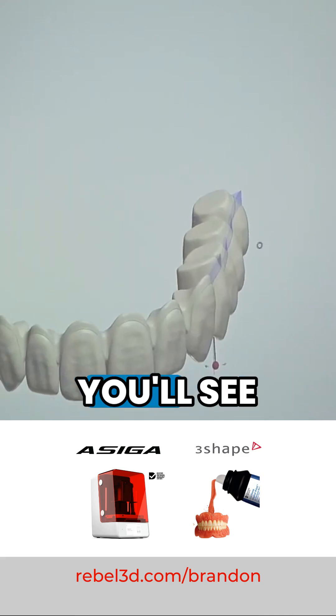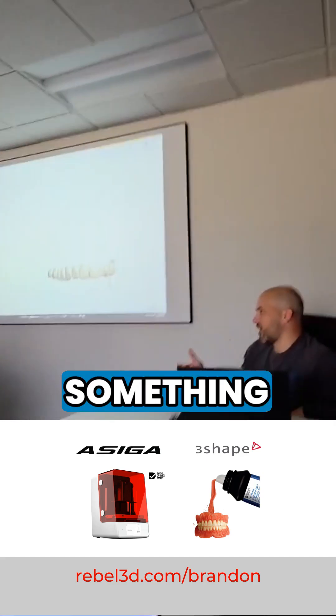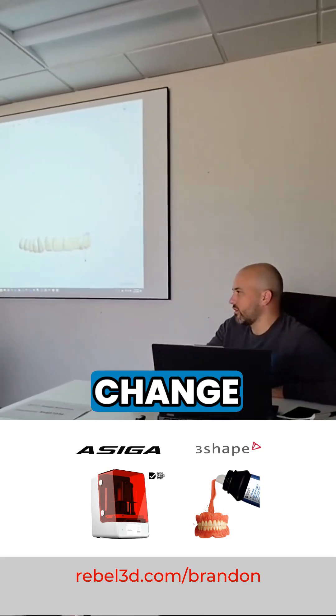When I hit preview here, you'll see how it changes this last one. It does it automatically. Now, every once in a while you'll get an error saying that you need to adjust something — that's when I'll make a change. But I usually go by the default. If it comes up fine, I don't change anything.